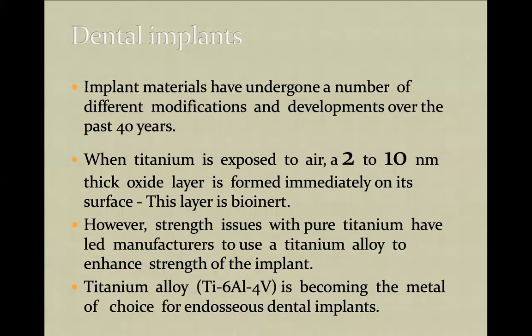So why are we discussing this so much, why is it important? I think that we have more than 1,000 manufacturers that might provide us with dental implants, and the prices are different. That is the key point, because if you choose a relatively cheap implant, you might face these kinds of mechanical or biological complications.